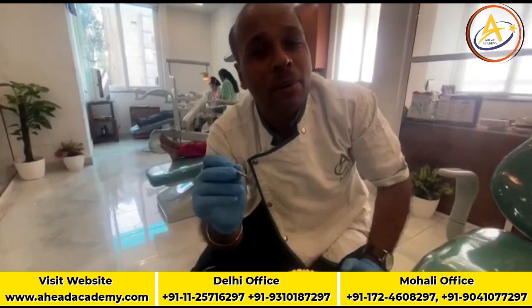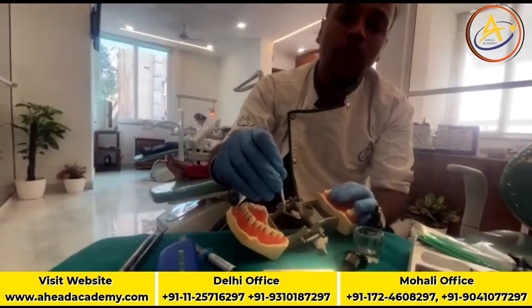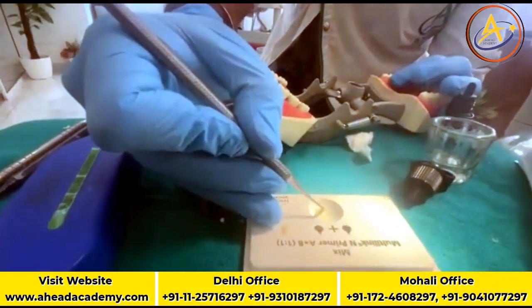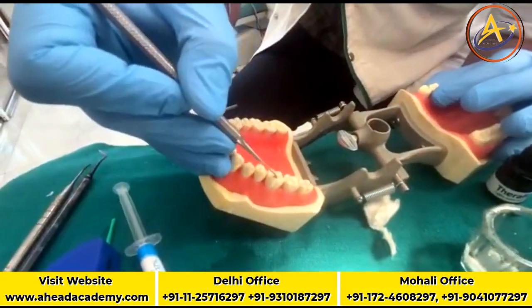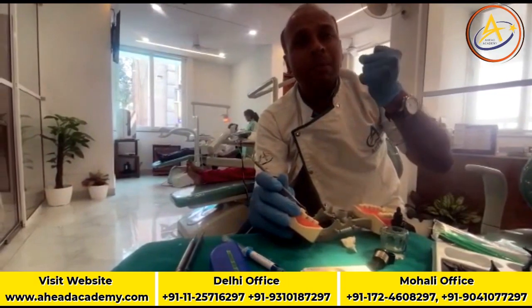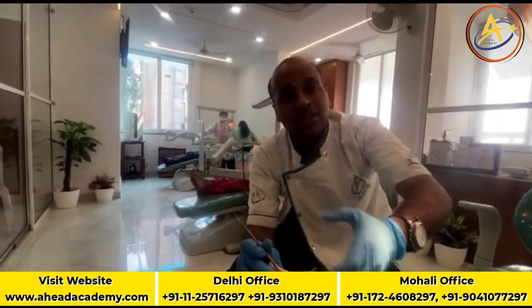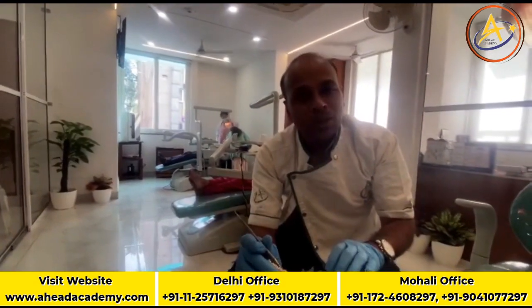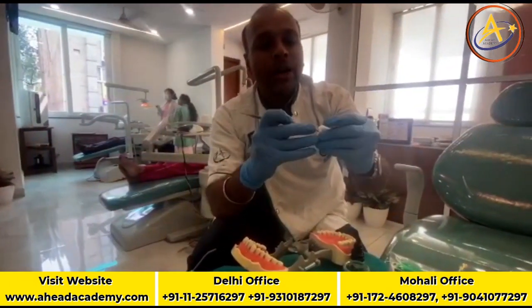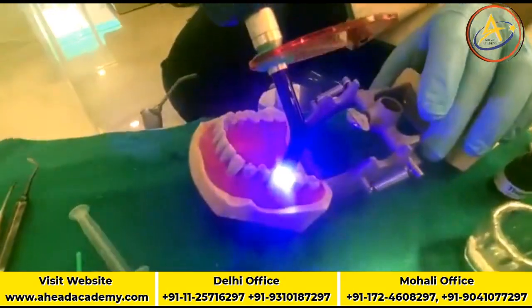One more thing, I have seen some of the operators, how they prevent the sticking of composite onto the instrument. Just see what they do. In between the application of the composite, they always dip the instrument like this in the bonding agent to prevent the sticking. This is absolutely wrong. Why? We are incorporating too much bonding agent into the composite. The main strength of composite is the volume of the filler. When we are incorporating more and more resin, that is the bonding agent, the strength is reducing. So please do not use the bonding agent this way. The best thing is to use a cotton dipped in alcohol for cleaning your instrument, and then you can condense the composite properly and cure it with your curing light.